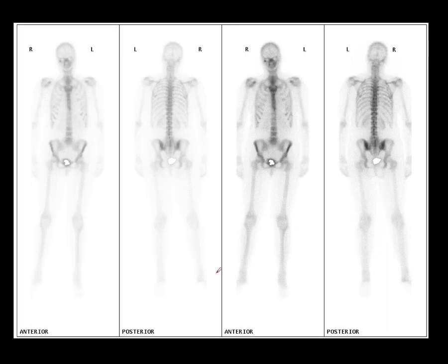A couple more examples of fibrous dysplasia, because it's an important one. Here's a patient with a focal area of activity around the orbit. One possibility is contamination — if a patient is passing urine and touches their face, they can leave a small amount of radioactive urine there. Cleaning the area and repeating a spot view can help eliminate this. In this case, however, we thought it was a genuine abnormality.